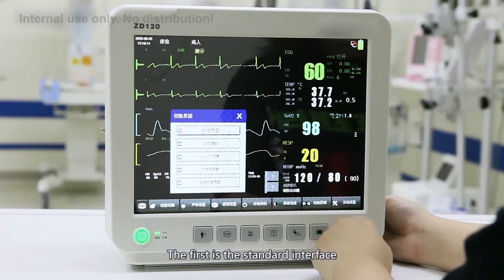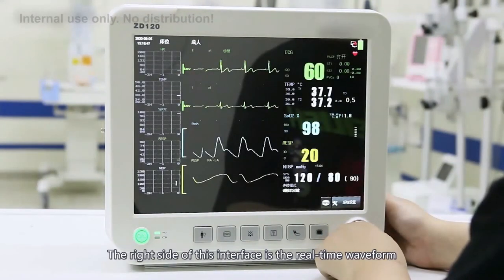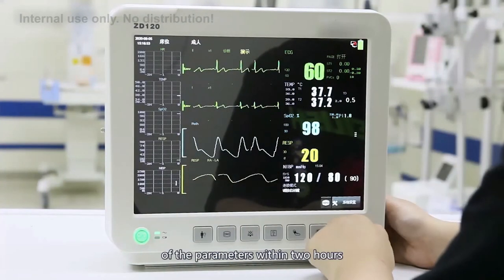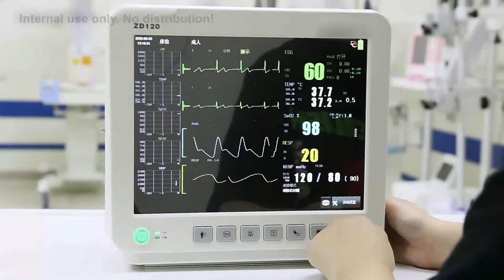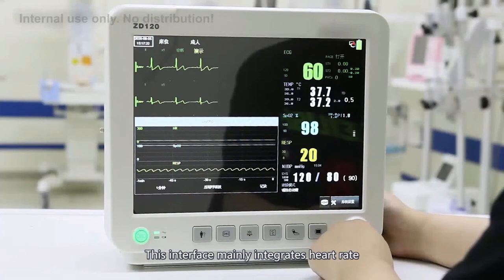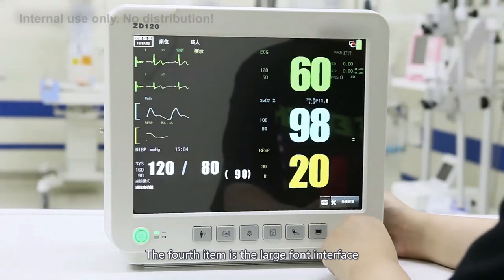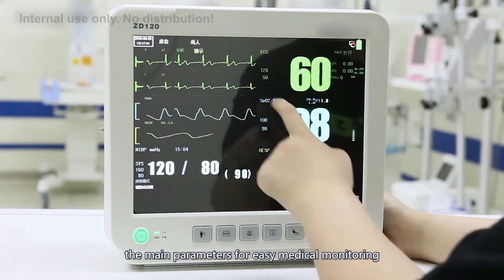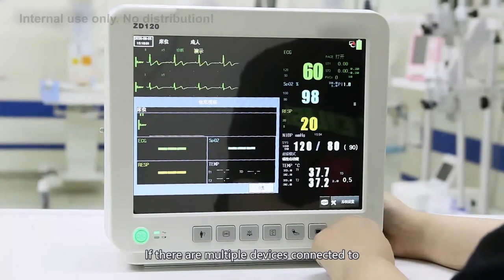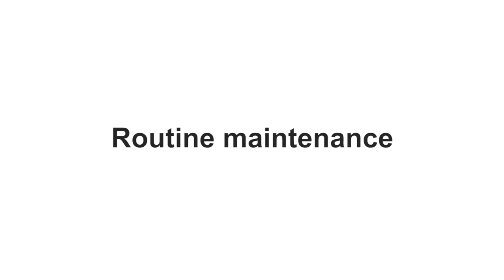The last and most frequently used interface is the interface switching menu. There are five options in total. The first is the standard interface. The second is the dynamic trend interface, where the right side shows real-time waveforms and the left side shows parameter trends — you can see trend changes within two hours. The third is the blood oxygen volume waveform interface, integrating heart rate, respiration rate, and blood oxygen saturation. The fourth is the large font interface, which enlarges the main parameters for easy medical monitoring. The last is the other-bed observation interface, allowing you to view parameters from other monitors connected to the network.